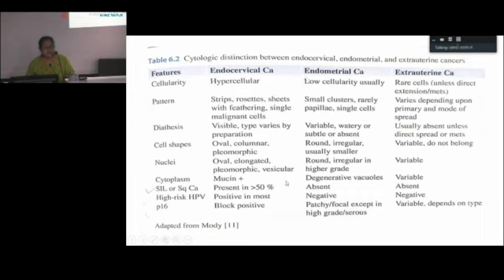So how will you differentiate between all of these glandular carcinomas on cytology? By looking at cellularity of the smear, pattern, tumor diathesis present or not, cell shape, nuclei, cytoplasm, coexistent squamous intraepithelial lesion or carcinoma, high-risk HPV present or not, and IHC with p16, which can be done on cell block prepared from the preservative fluid.